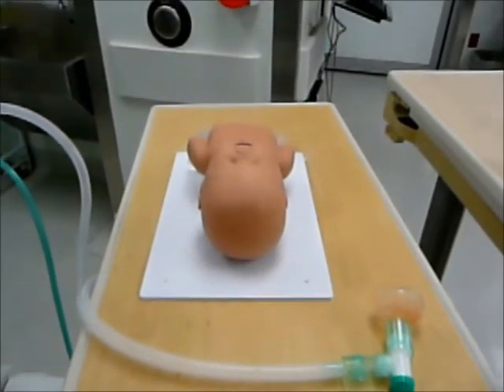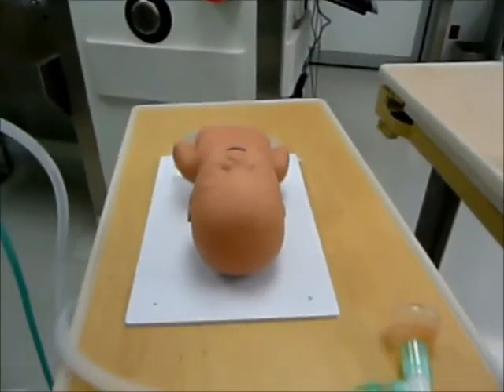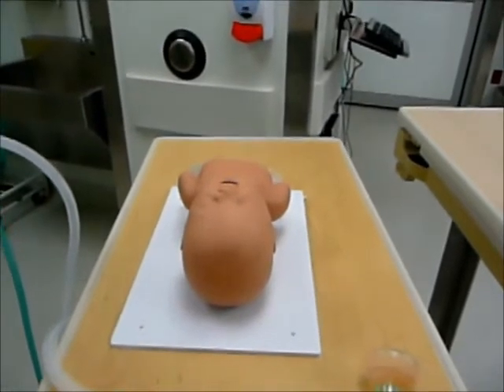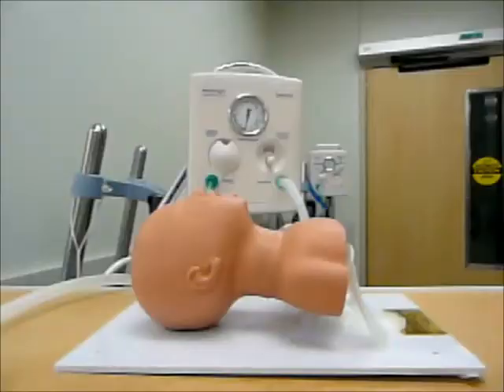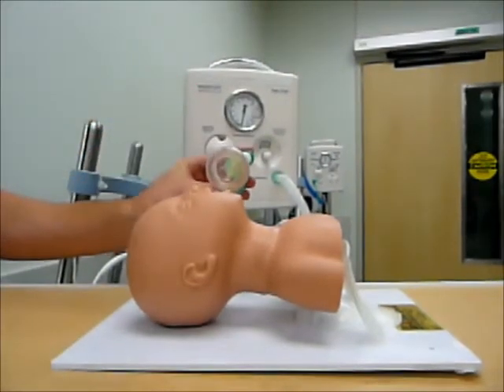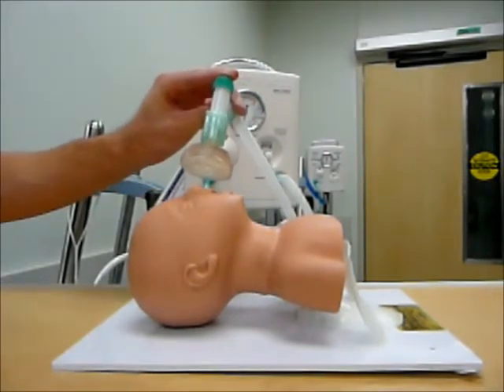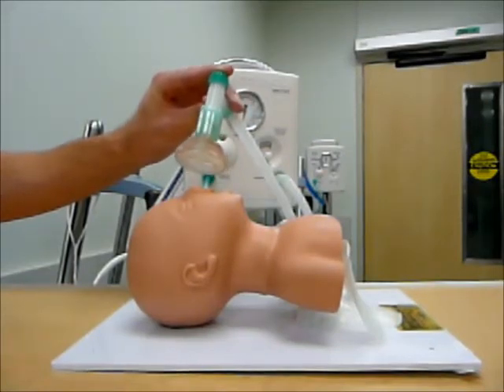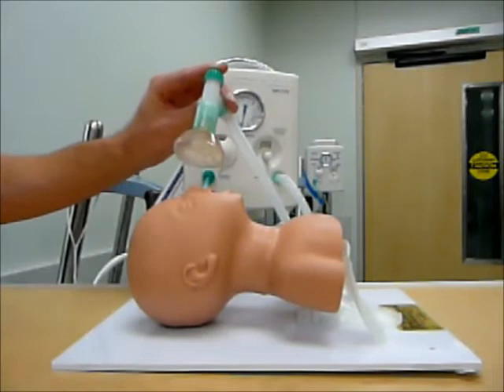Now that I have my Neopath all set up, I have gone ahead and placed the mask to the end of my circuit. There are three things we can do with a Neopath: we can provide free flow oxygen, we can provide CPAP, and we can also provide positive pressure ventilation. In order to provide free flow oxygen, what we want to do is block the end of our green cap with our finger, but we don't actually want to create a seal on our patient. We don't want to provide positive pressure ventilation, so I am just having my mask nicely close to the patient's face but not actually providing a seal, while blocking the green cap allowing all the flow of gas to come into the circuit and down towards my patient.